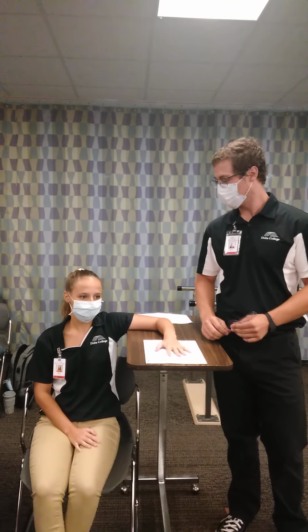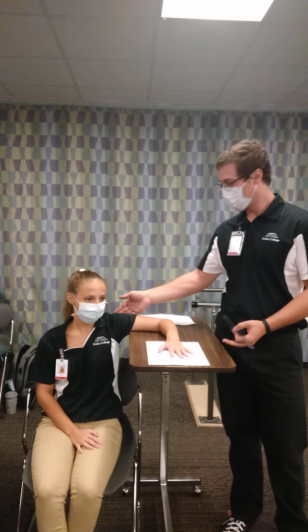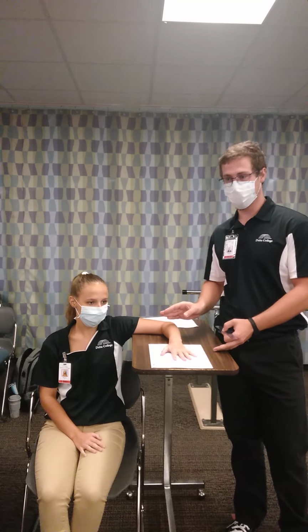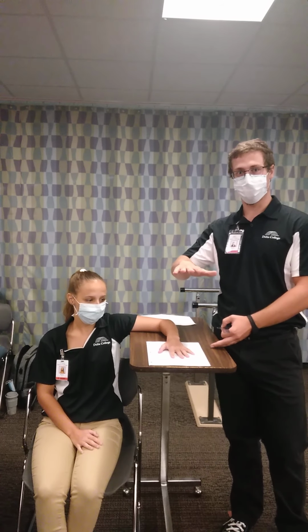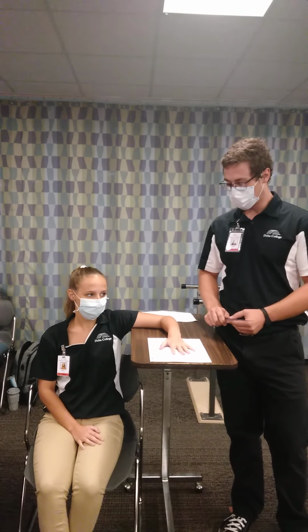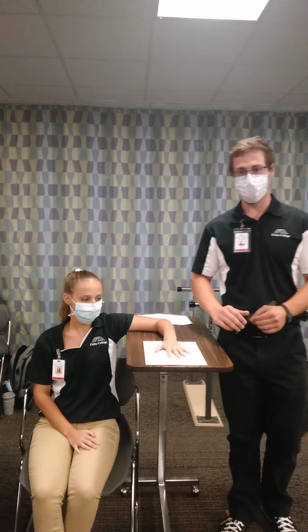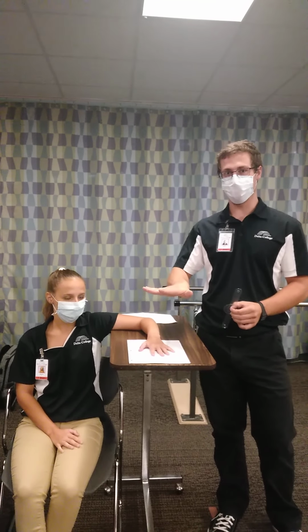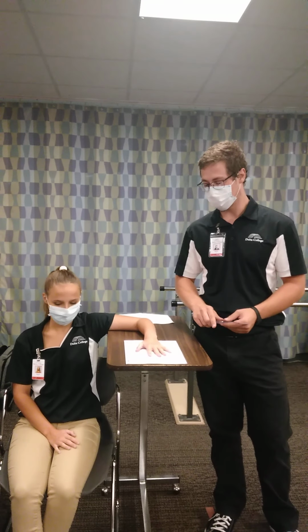So to start off, you're going to want your patient sitting, their arm abducted to 90 degrees and their elbow flexed to 90 degrees. And you're going to want their hand in a neutral position. So normative values for radial deviation are 20 to 25 degrees, and then for ulnar deviation it is 30 to 40 degrees.